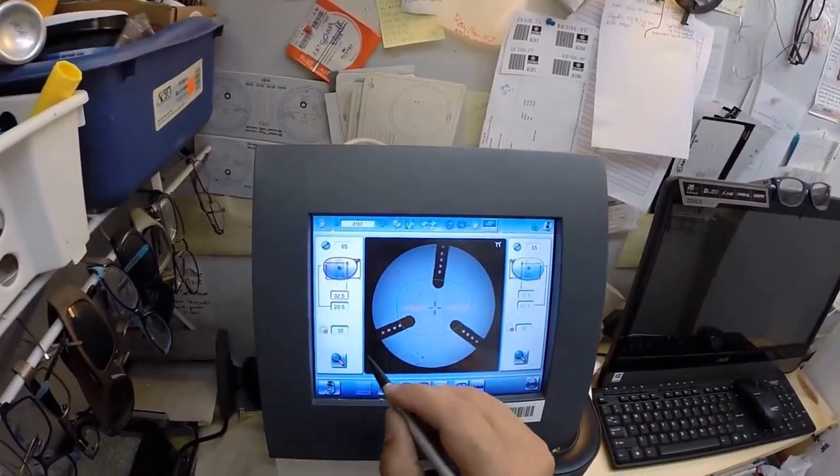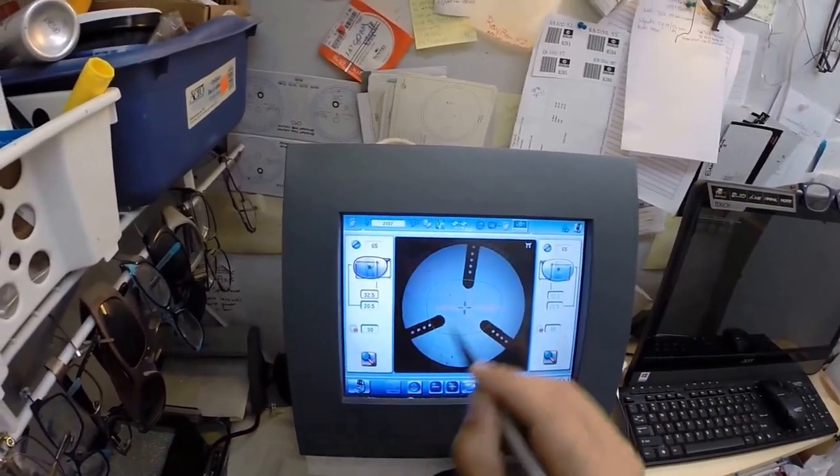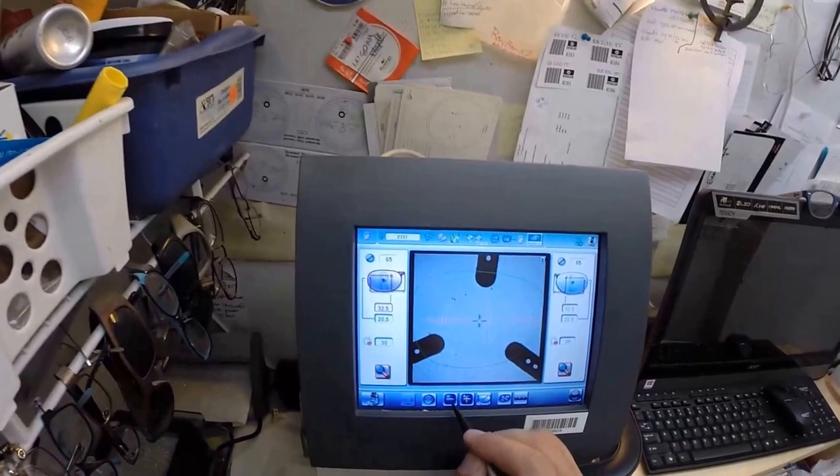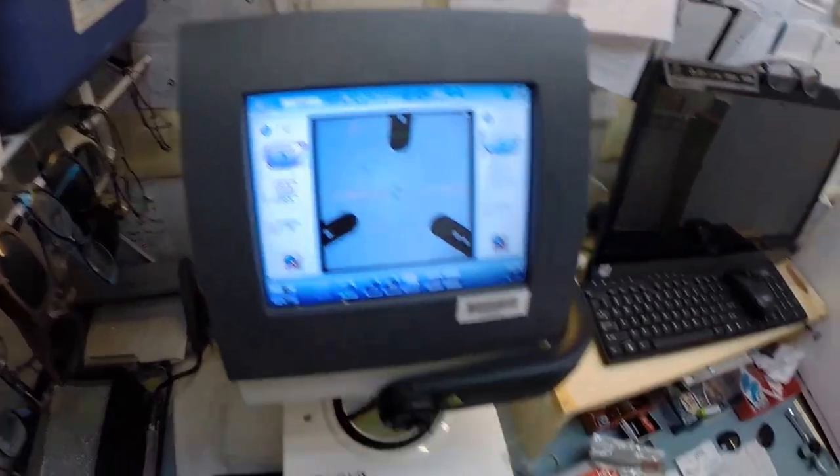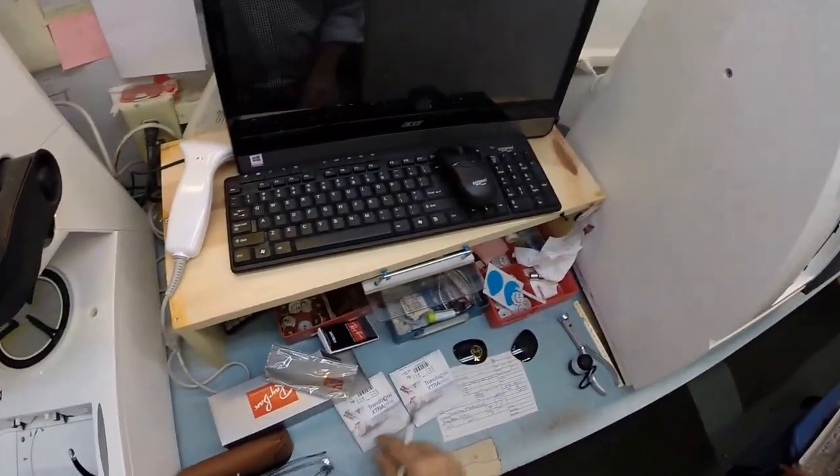That green outline - let me magnify - that is going to be the shape of your lens. Your pupillary distance is 63 in both eyes, that is 31.5, so I'm going to bring that down to 31.5 and let's go ahead and get your lenses prepped.